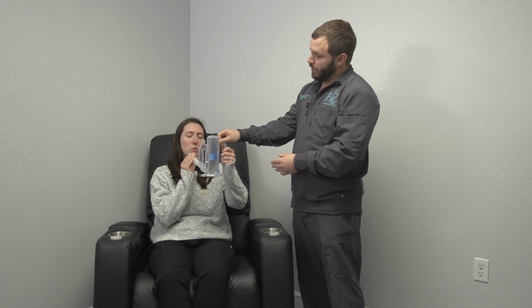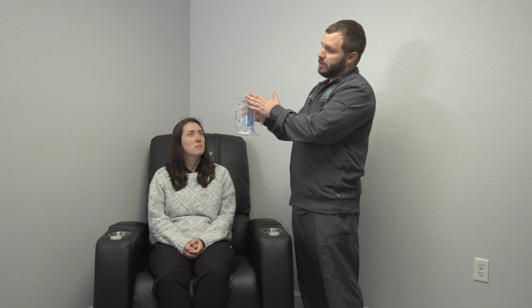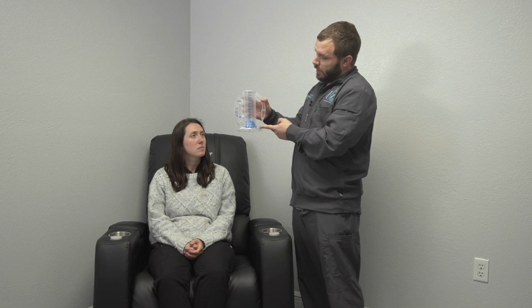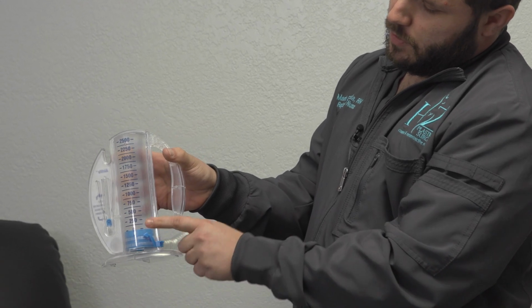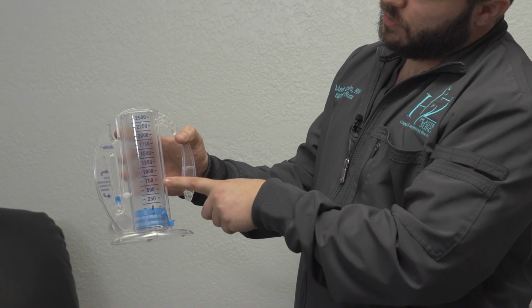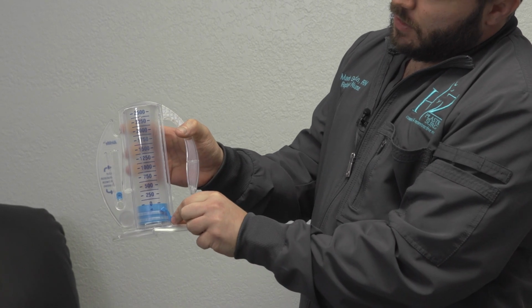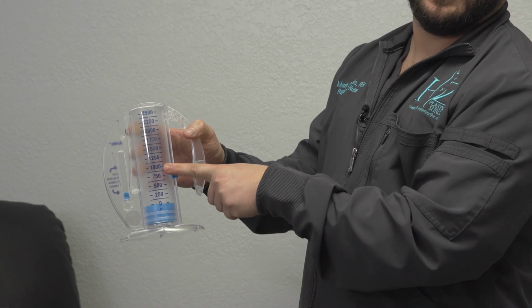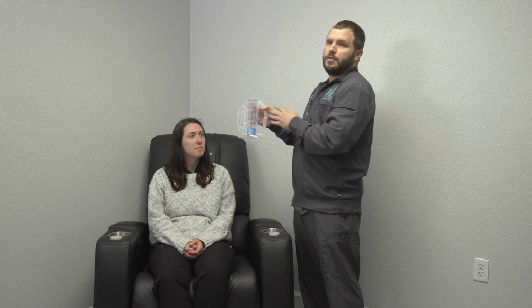The other thing I want to point out with this device is, if you can't get it all the way to the top, in order to keep going higher and higher each time you do it, there's this little arrow here. For example, if she was only able to get it to 1,000 the first time, all she'll do is bring that arrow up to the 1,000 mark, and now she knows that her goal is to try to get up and past that. And that is how you use the incentive spirometer.